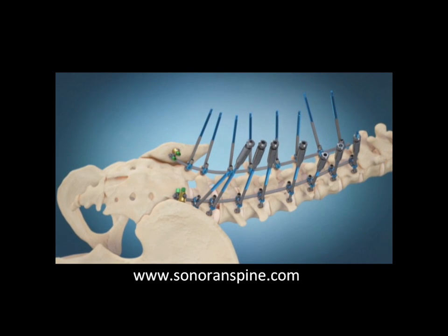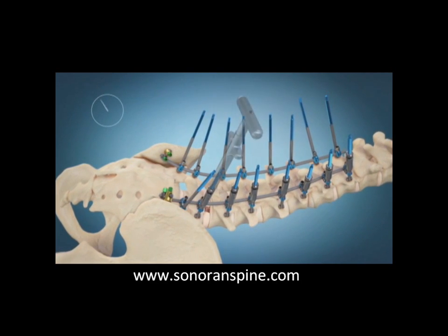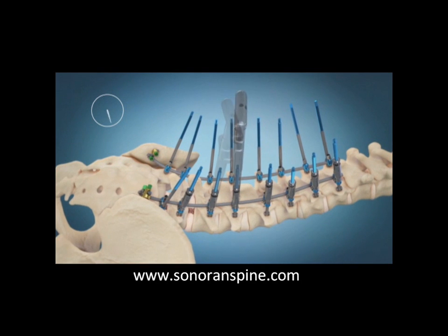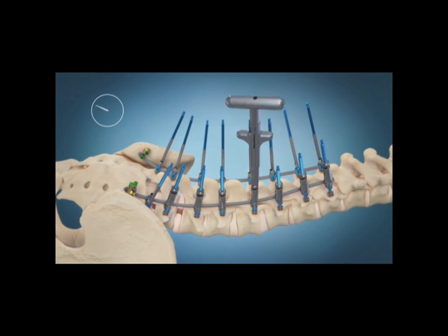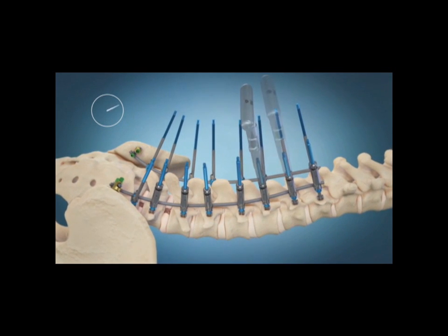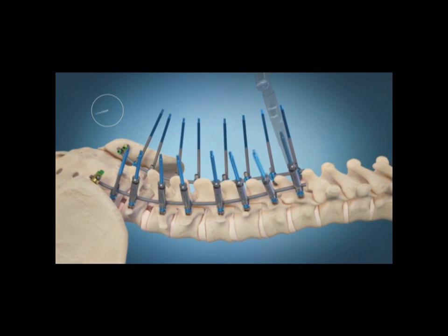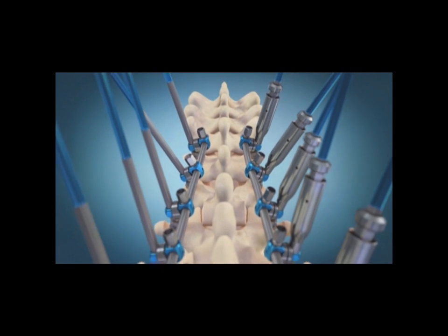These unidirectional rod crimps are placed over the posts, and incrementally, gradually, with low stress on each screw, these are gently pulled back into place, correcting the coronal plane, the sagittal plane, and the rotational plane, all by pulling the vertebra to the rod. The time that it takes to do this is anywhere from 5 to 30 minutes.